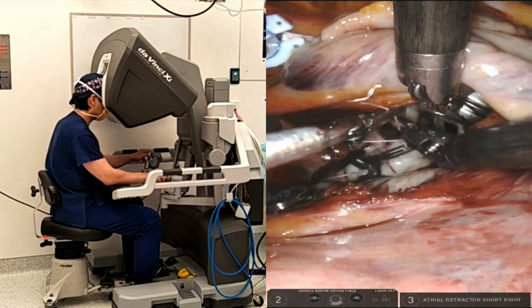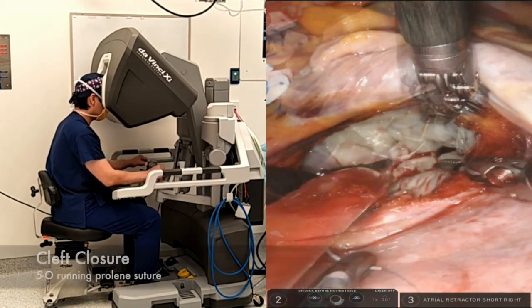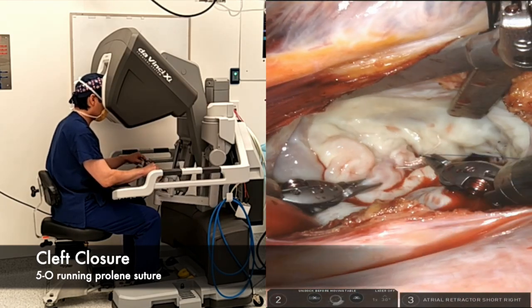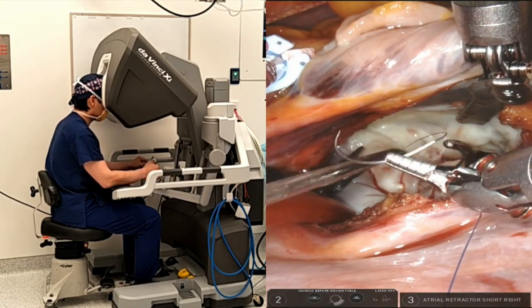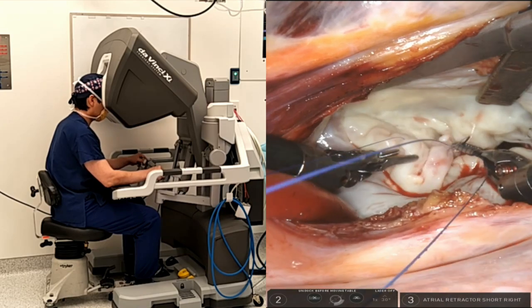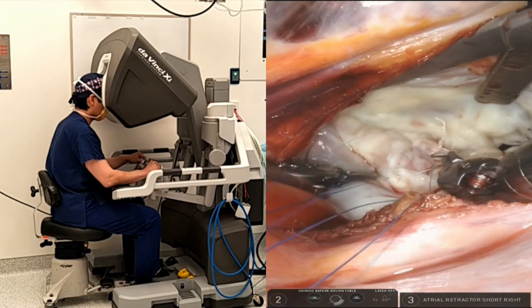In this case, I also decided to close the cleft between the P1 and P2 segments. Because the P1 segment was held down by the calcified subvalvular apparatus and P2 was prolapsing, the cleft was closed with a fine running prolene suture back and forth.